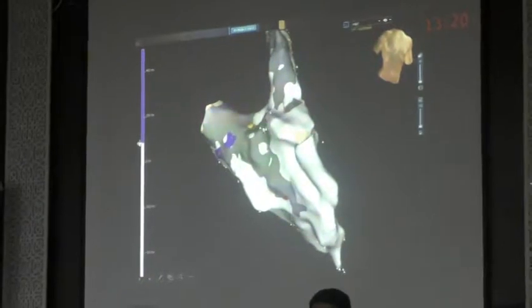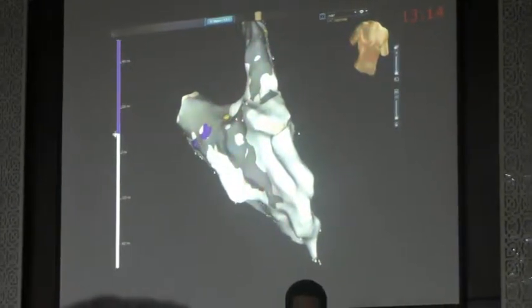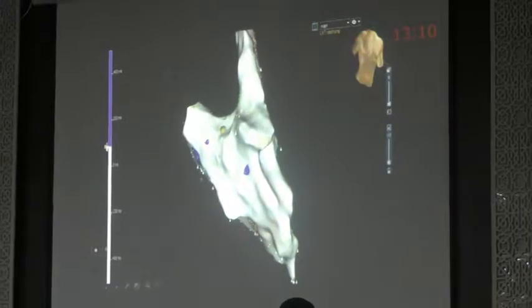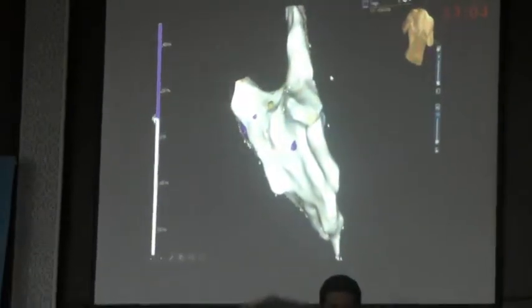Endocardially, there was no evidence of late potential except a small localized area near the tricuspid valve laterally here, which we see even in normal people sometimes. This is the late potential map. Again, we remove the scar. Again, there is a limited area of late potential, but there is nothing in the RVOT or the RV free wall.